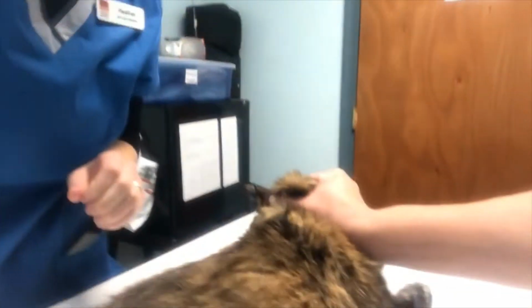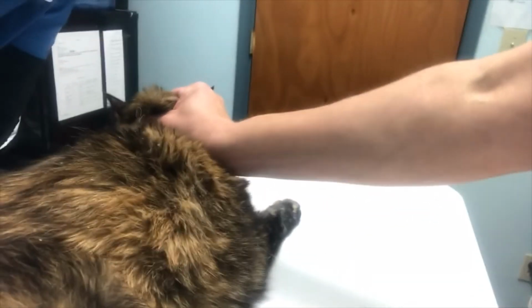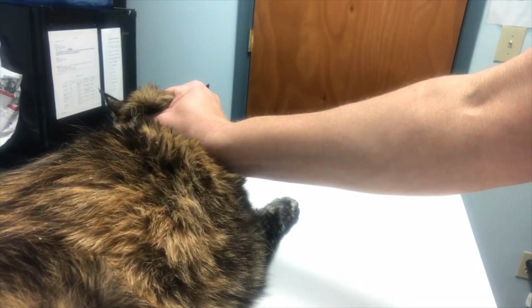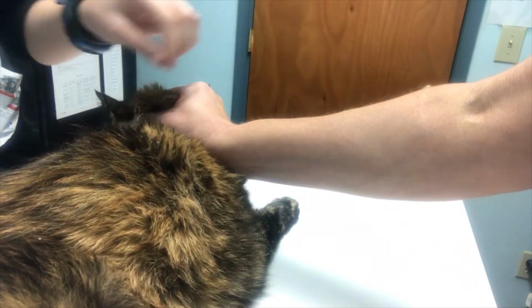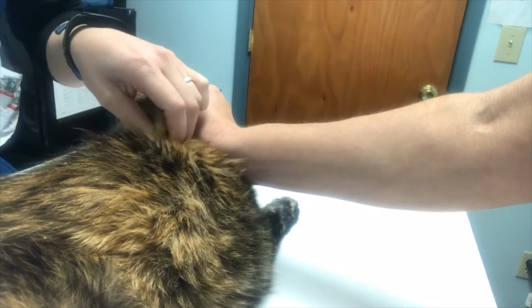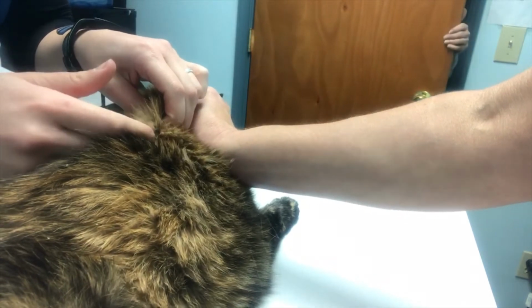So I'm going to demonstrate giving sub-Q fluids on Gracie May here. Here we have our bag of fluids ready with a fresh needle and IV line. I'm going to put the camera here. Alright, so for this, a good spot to go is in between the shoulder blades, as there's plenty of pocket there for the fluids to go into.